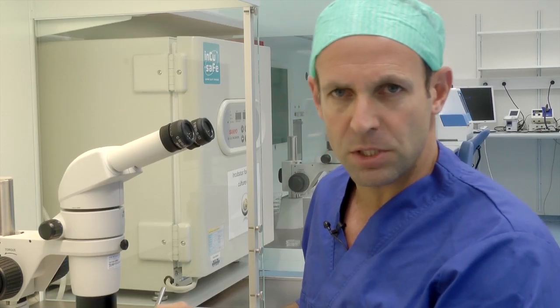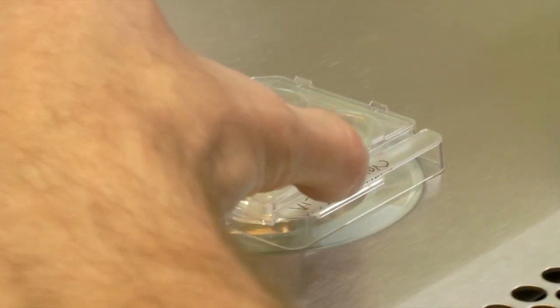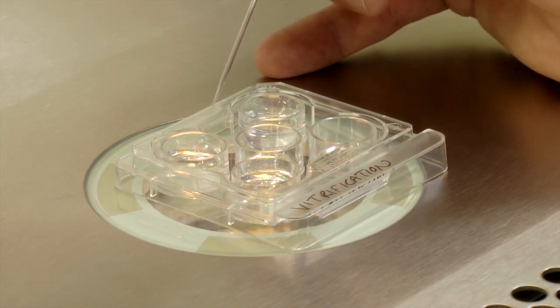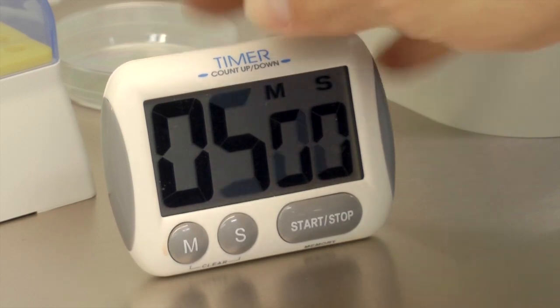When you start the vitrification procedure, place your oocytes in the first solution for a minimum of 5 minutes. Depending on the number of oocytes you have, the procedure will take between 5 and 20 minutes. We recommend, however, that you don't use the dish for longer than 20 minutes.